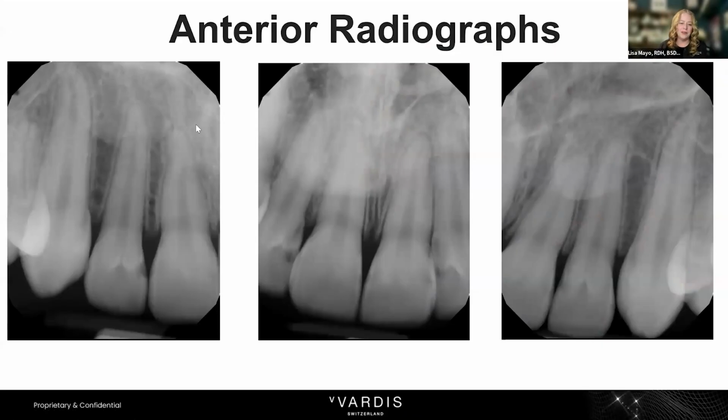Annie, what jumps out to you first? Obviously, just how fast the progression went, right? Crazy. 4 months. He gets x-rays every 4 to 6 months. It kind of just depends on how his teeth are looking. This was a 4 month. He wasn't overdue for his recall. His mom is me. He ain't gonna be overdue.